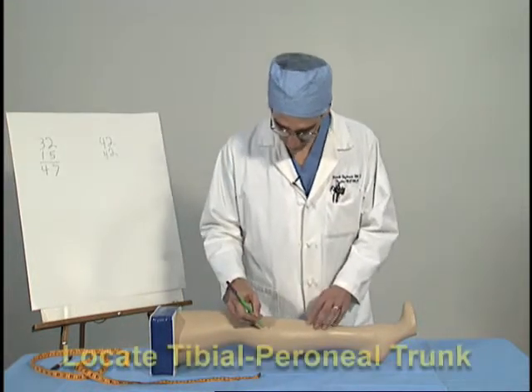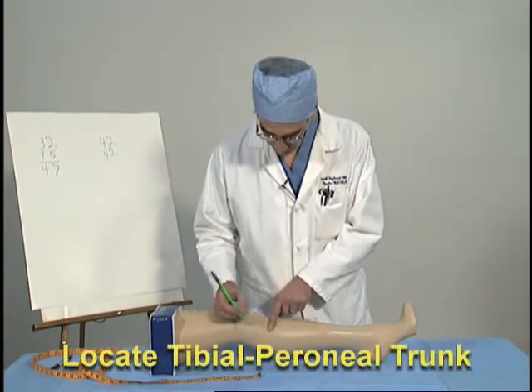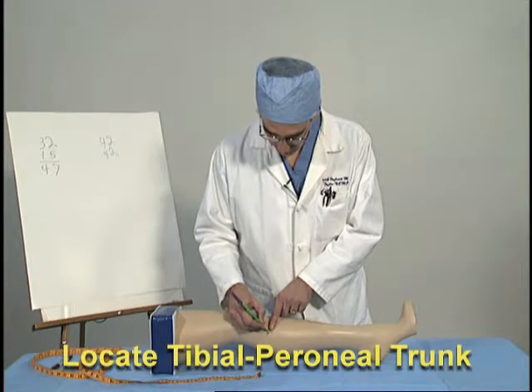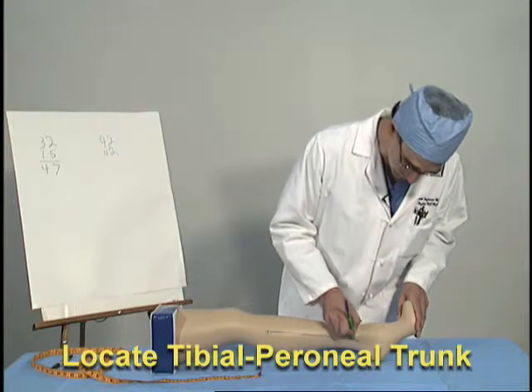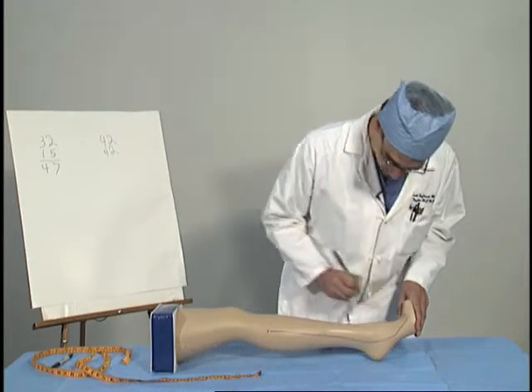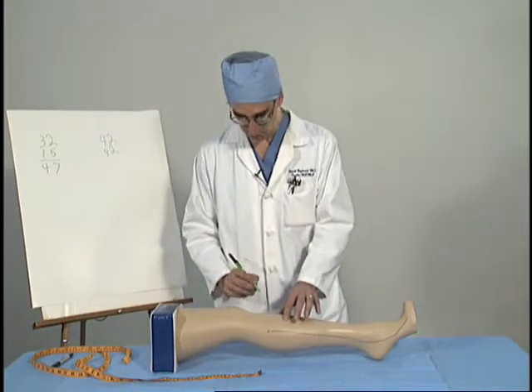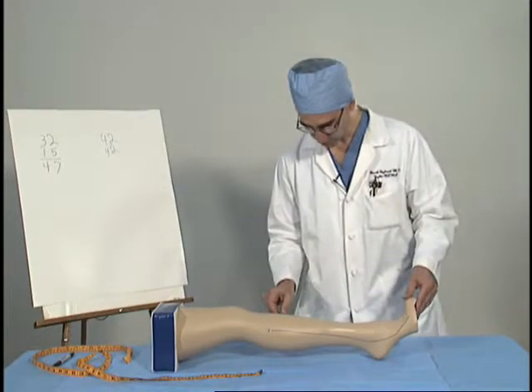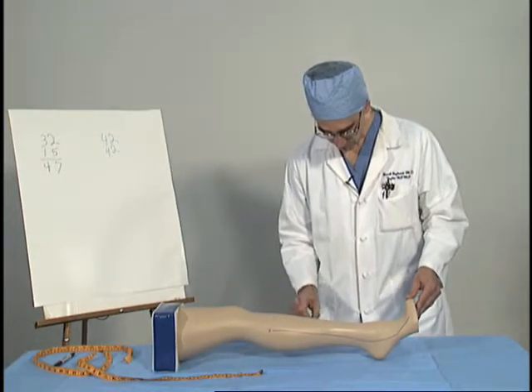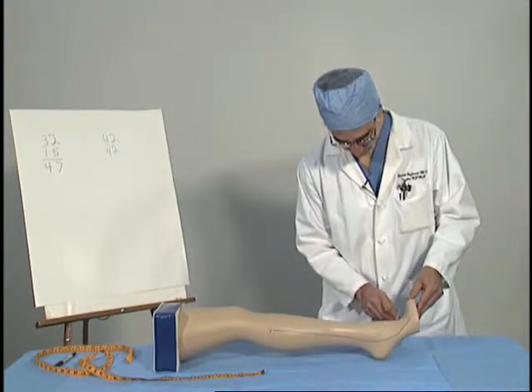Therefore, although we will again find our tibioperoneal trunk, mark the site, measure our distance, do the same over the anterior compartment, just as in the last case, mark the site, extend onto the foot.